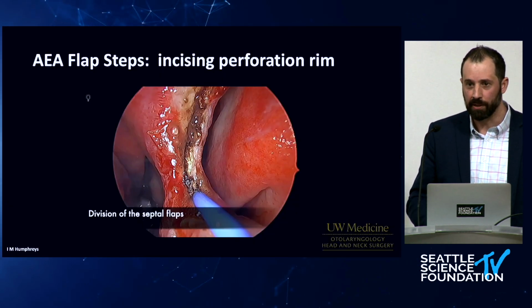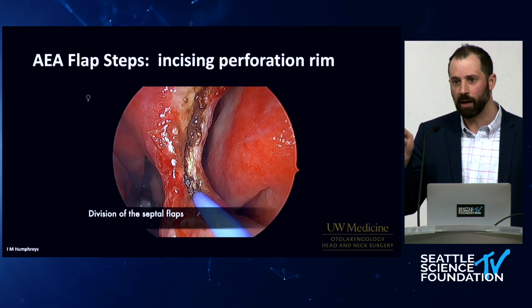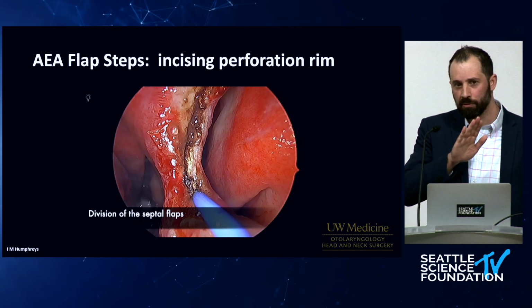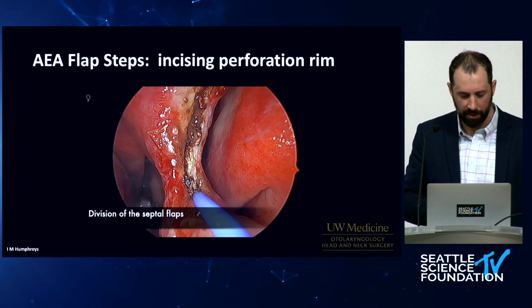So this is where it begins. I've already made the assumption we have a septal perforation. We've already done our diagnostic endoscopy. We're in the operating room for a septal perforation repair, and I want to walk through some of the salient steps that we're going to use. Then we'll put it all together in a video and try to tie it up and understand how this can be helpful as a tool in our toolbox.